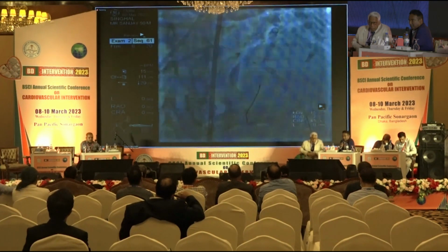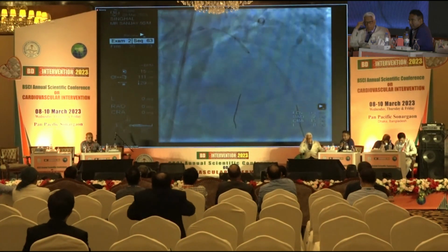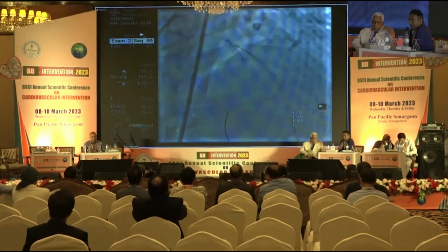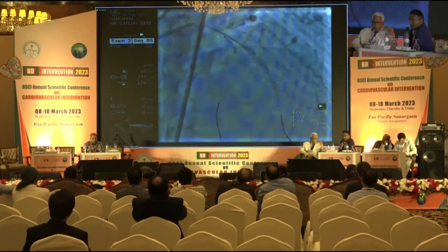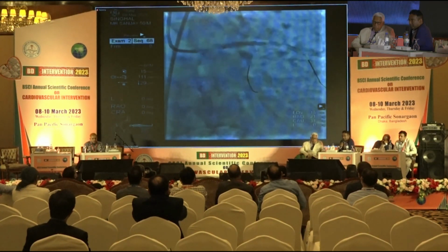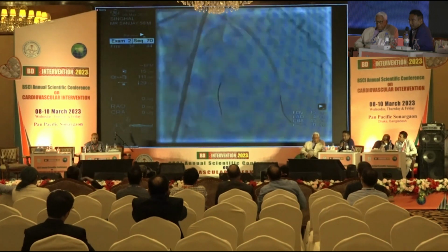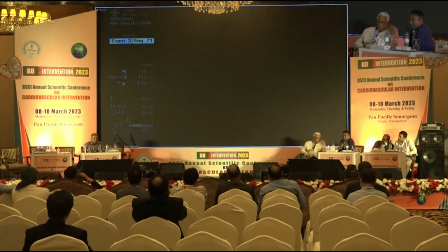And then we did a mini crush to the stent, putting a stent into the septal after having good adequate dilatation. We did a mini crush to that septal because it was dissected and closing up again and again. After having crushed that with the LAD stent, which you can see is adequately dilated in the RAO projection and also in the LAO projection, we then went ahead and recrossed into the septal. Excellent result, sir.